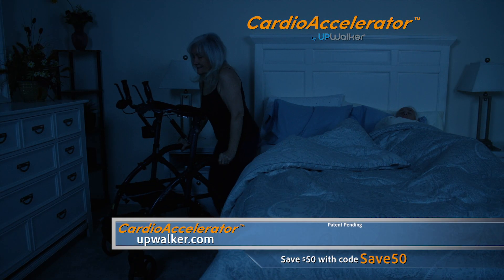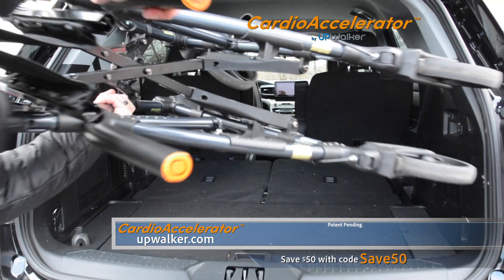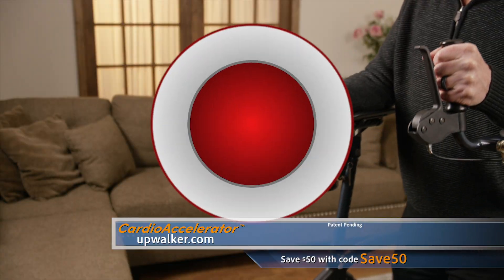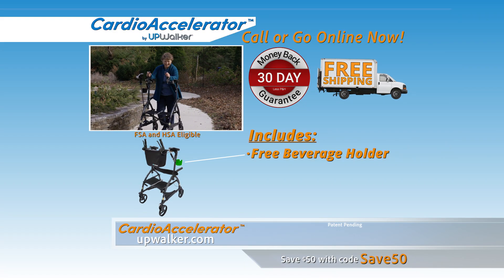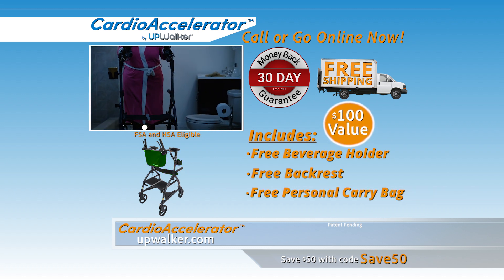Call or go online right now to receive specially discounted TV pricing. The Cardio Accelerator is easy to fold and transport, and we now have affordable, easy payment plans, backed by a 30-day money-back guarantee. Call now and get free shipping, a free beverage holder, a free backrest, and a free personal carry bag, which is over a $100 value.